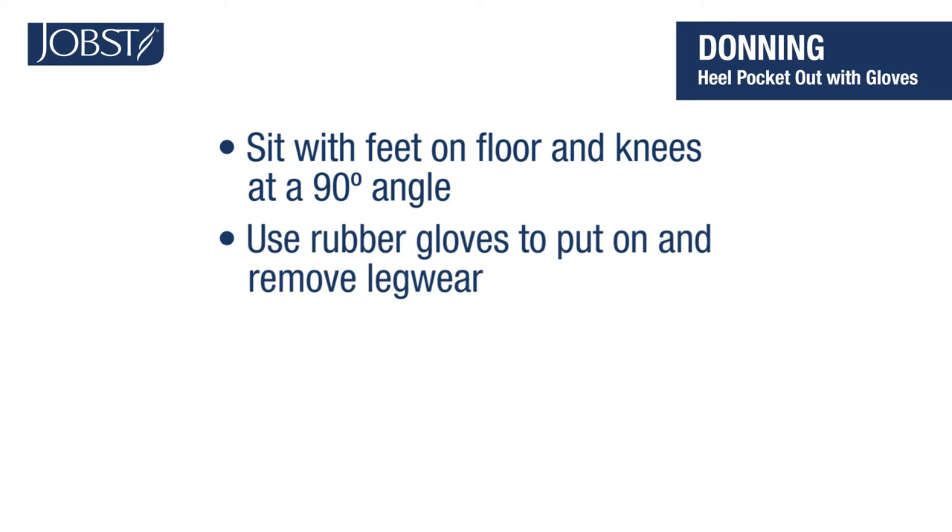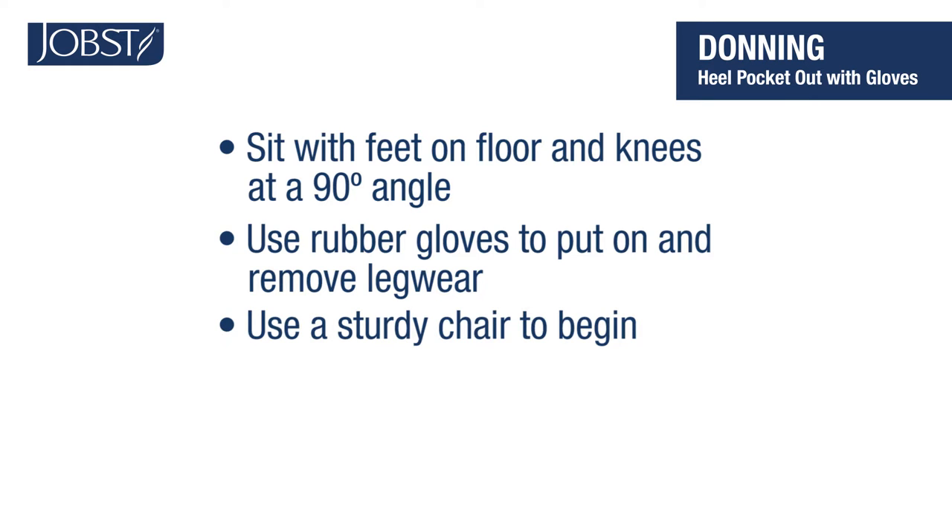If you prefer, you can use your rubber gloves when you put on and remove your compression stockings. They can help protect the hosiery from nails or dry skin. Find a sturdy chair and let's get started.